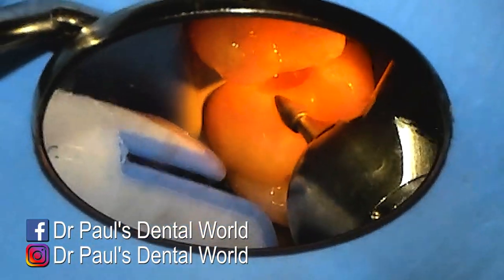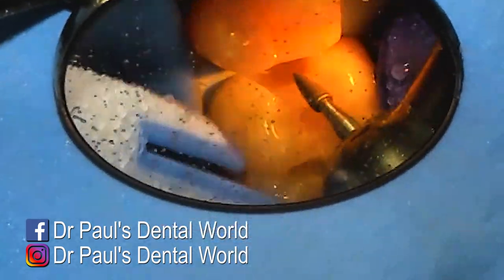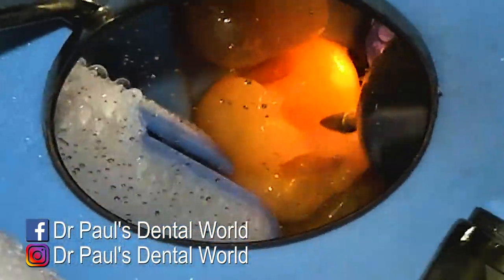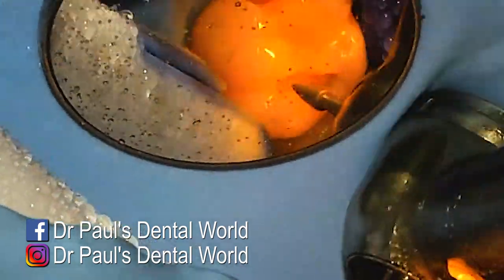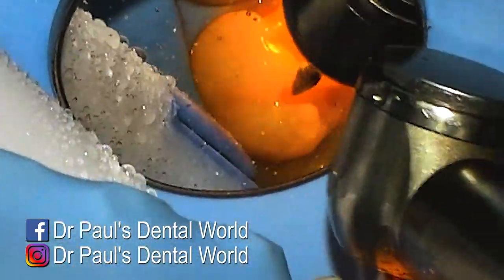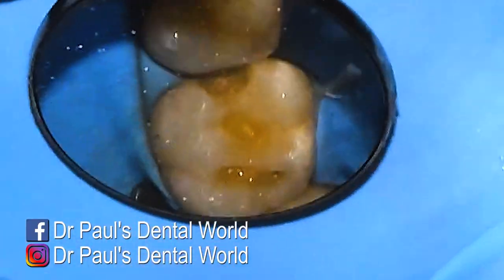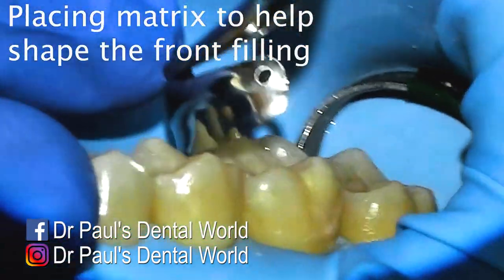Once I've done that, the last bit is to go around with a flame burr to do what we call a slight bevel to the tooth. On the enamel margin, I'm putting a very thin high-angled bevel to remove unsupported enamel but also to open up the enamel rod slightly to get better bond strength. I do this on any surface that I have access to, and this is my cavity preparation done.